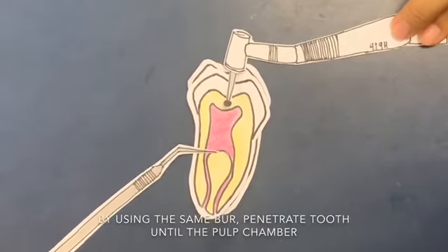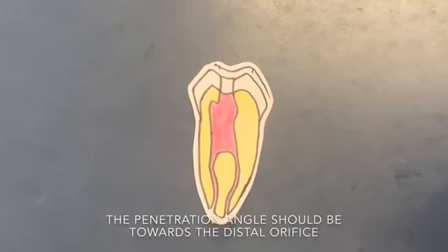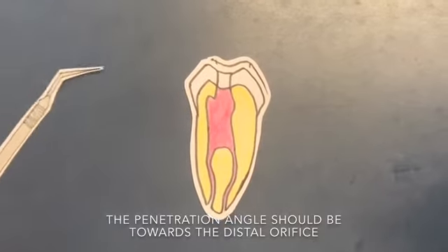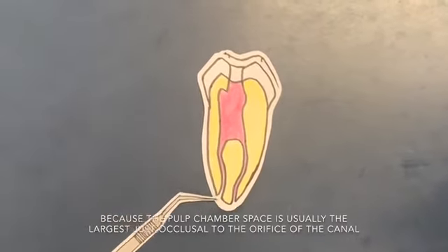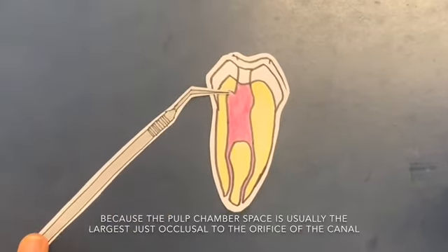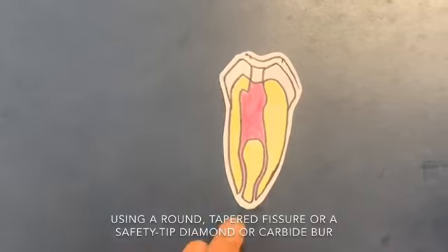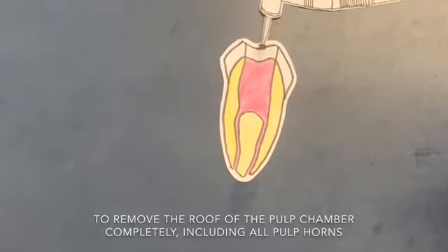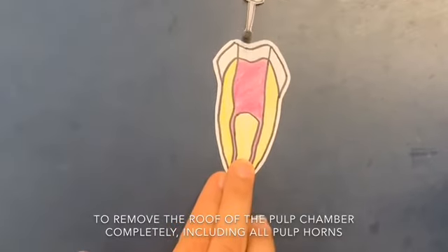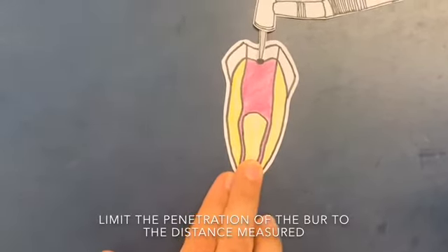Using the same burr, penetrate the tooth until the pulp chamber. The penetration angle should be towards the distal orifice because the pulp chamber space is usually the largest just occlusal to the orifice of this canal. Use a round or a tapered fissure or a safety tip diamond or a carbide burr to remove the roof of the pulp chamber completely, including all the pulp horns. Limit the penetration of the burr to the distance measured.